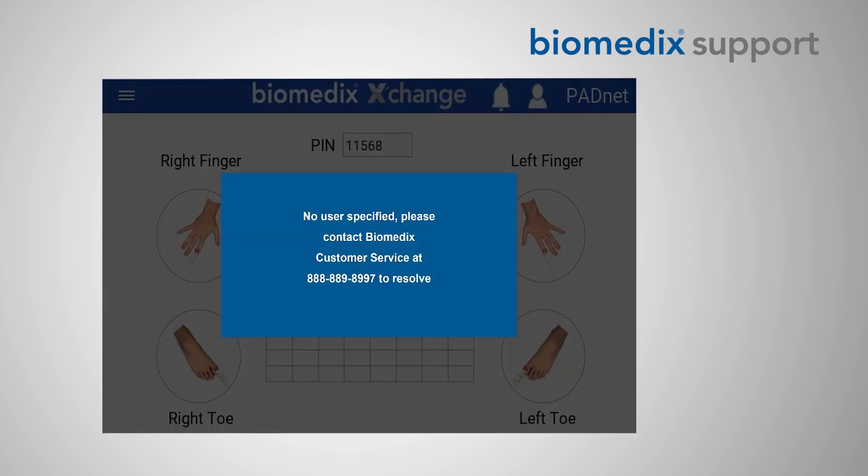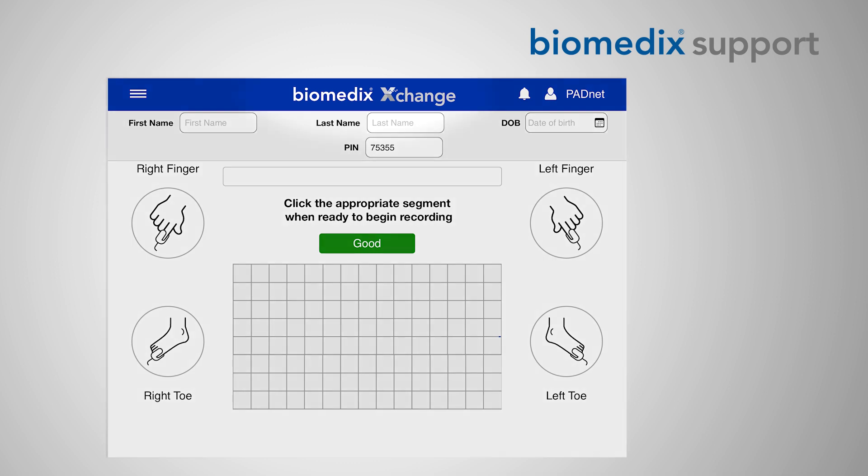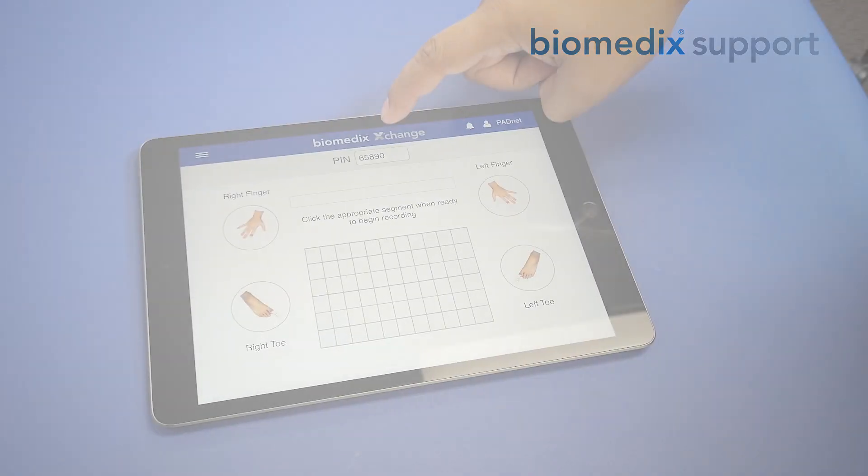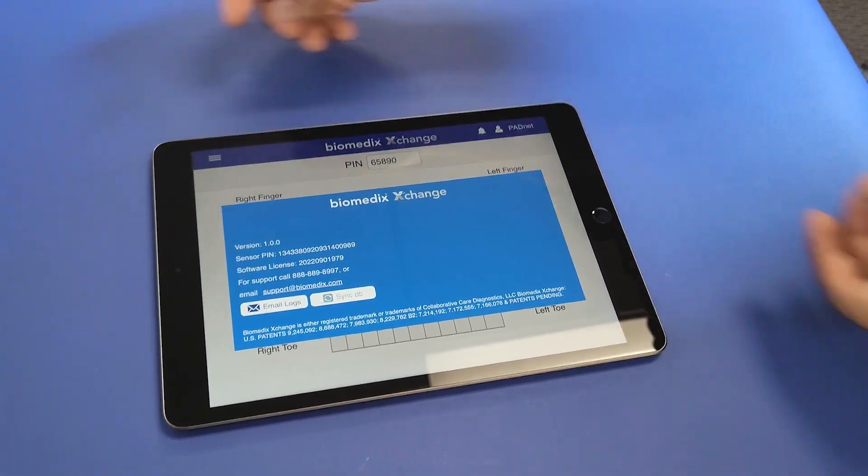Upon opening the application, you may receive a notification informing you that no registered user is attached to this device. Hit anywhere away from this notification to close it, and then click or tap the Biomedics Exchange logo at the top of the screen to reveal some basic software information.